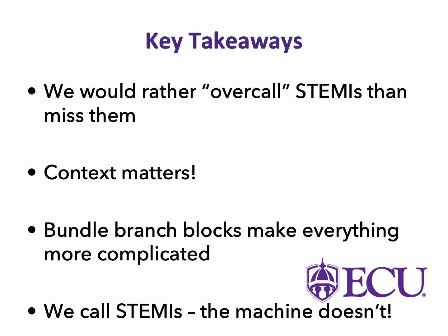Just because the machine may say STEMI on it does not mean that the patient is having a STEMI, and the converse of that is also true, right? Just because the machine does not say STEMI on it doesn't mean the patient might not be actually having a true STEMI. So use your judgment, use your training to determine whether a STEMI exists or not, whatever the machine says.